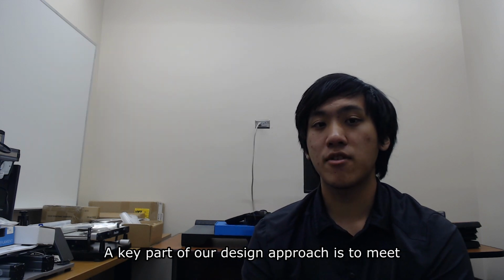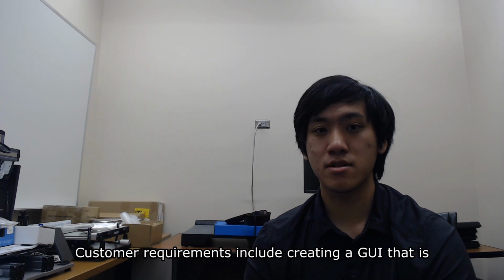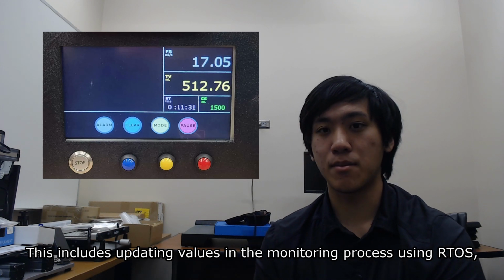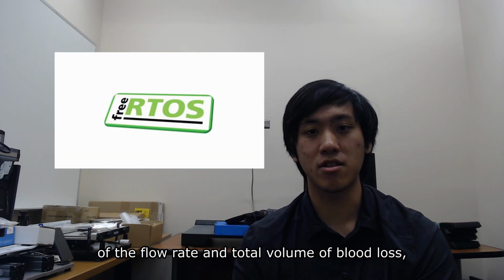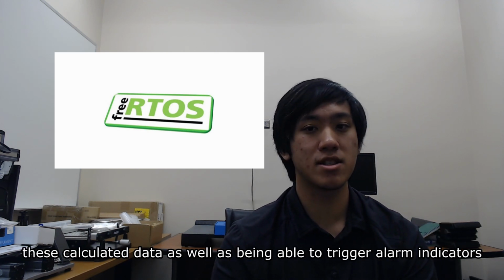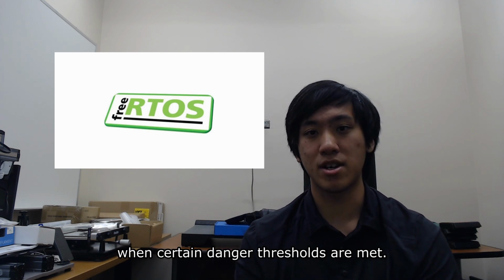A key part of our design approach is to meet customer requirements and take user feedback into account. Customer requirements include creating a GUI that is easily interpretable at a glance. This includes updating values in the monitoring process using RTOS, where on one hand, we have a core running the calculation of the flow rate and total volume of blood loss, and on the other core currently running is the display of these calculated data, as well as being able to trigger alarm indicators when certain danger thresholds are met.